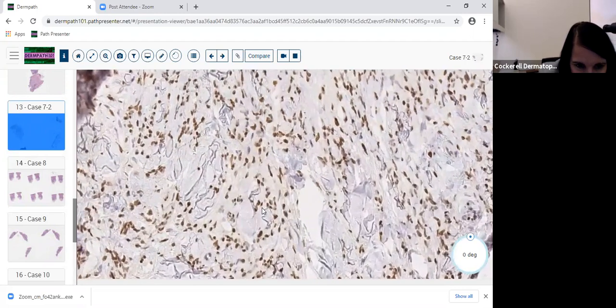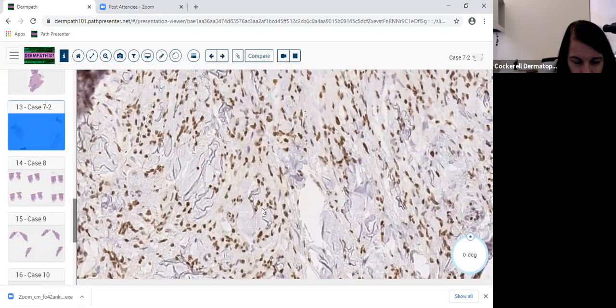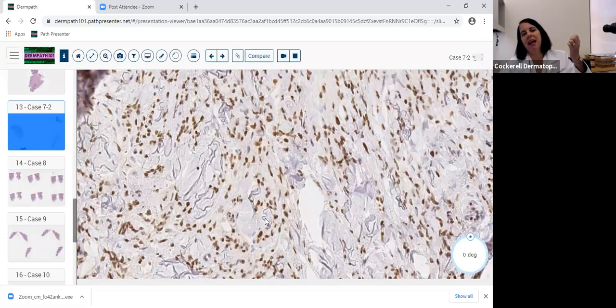with the immunohistochemical stain. It's SOX10, a transcription factor involved in neural crest. So you can see it in melanocytic processes, which this is, but you can also see it in salivary gland tumors. You can see it in myoepithelial cells and breast cancers. So it's not perfect for melanoma, but you can definitely use your SOX10 here to prove this is the intradermal process that's a benign blue nevus that arose in this site. So this is just a benign blue nevus, arose in this site, SOX10 positive, totally benign. You can move on to your next case.